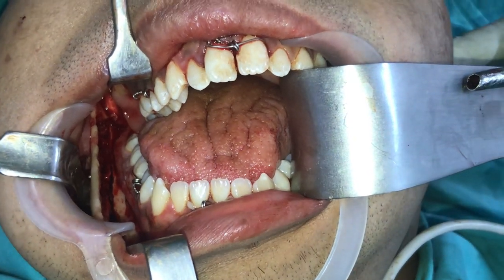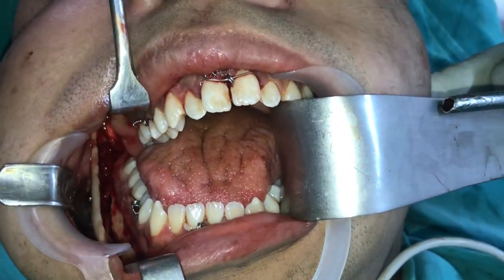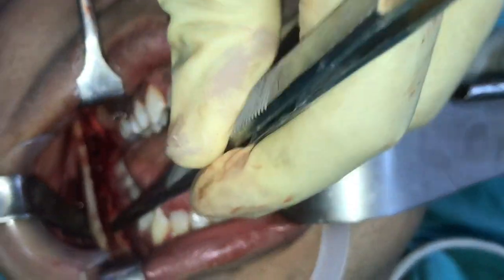We have just completed the bilateral sagittal split osteotomy. I am showing the split on the right side. You can see this is the mandible — this is the proximal segment and this is the distal segment.